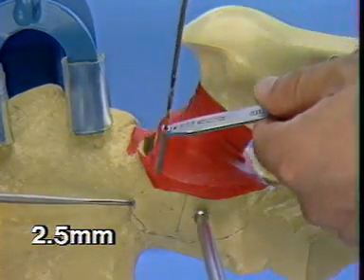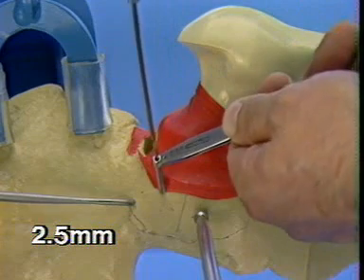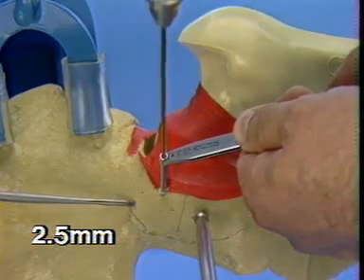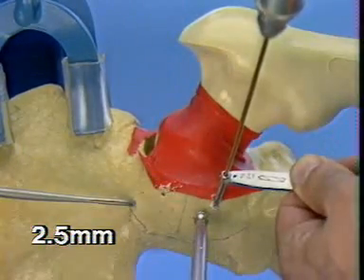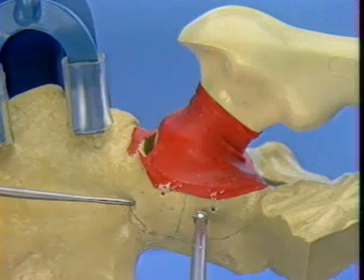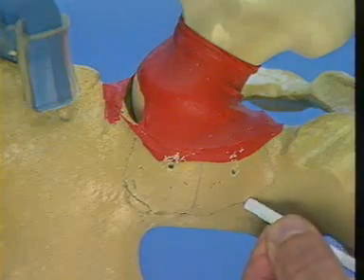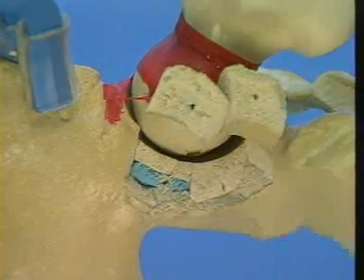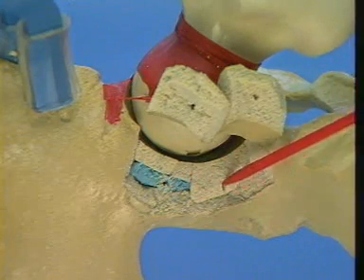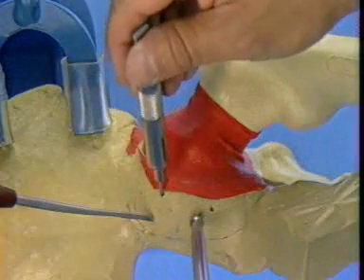With the patient in a lateral position, the 2.5 millimeter drill bit is directed vertically in order to avoid entering the joint. After drilling both holes, it's often advisable and quite instructive to redisplace the fragments of the posterior wall after drilling the hole in order to make sure that the screws will be outside the joint. The depth of the holes is measured.